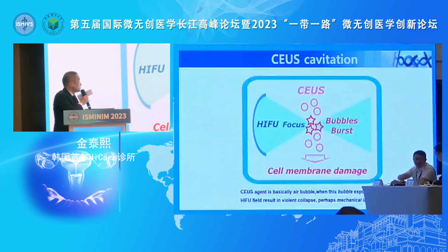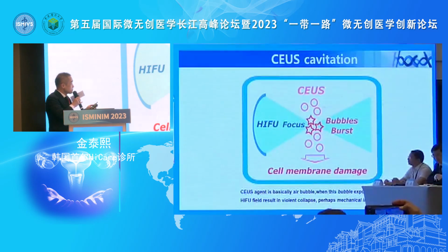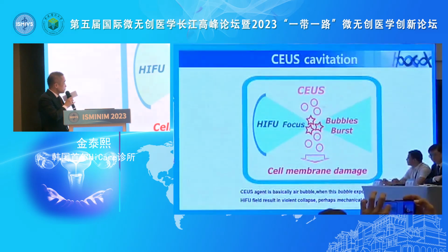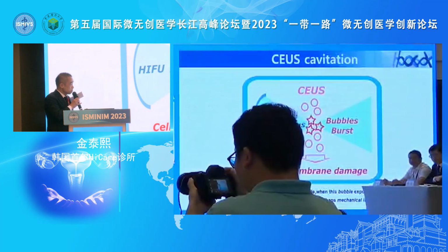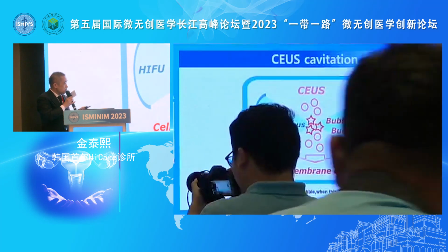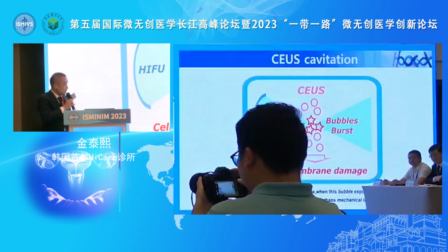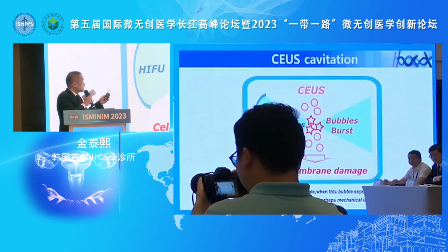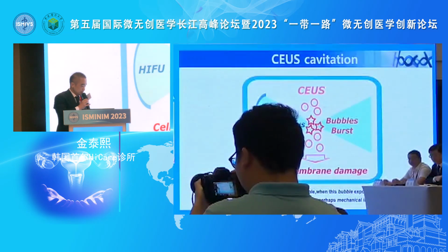Contrast enhanced ultrasound usually uses micro air bubbles. If these air bubbles are exposed to HIFU, the micro air bubbles suddenly burst, and this bursting makes cell membrane damage. So if we use CEUS, it makes more cavitation effect.